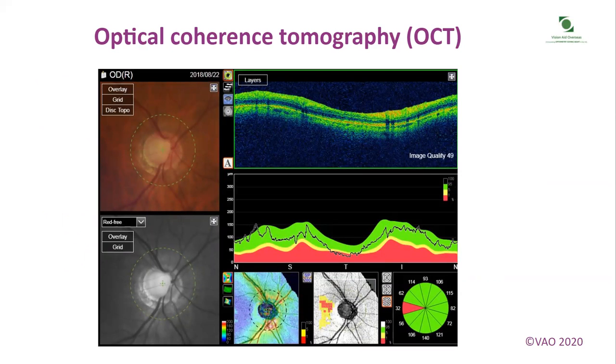This is a diagram showing the type of result you get from an OCT exam.